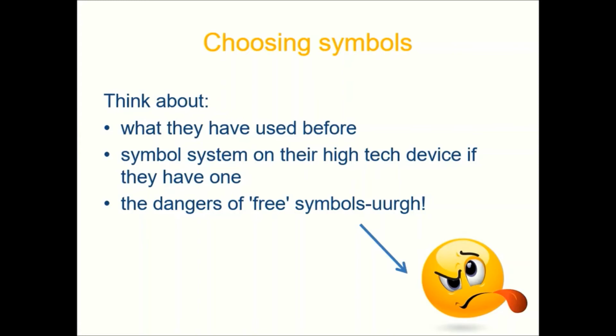So this one, for example, we've given as an example. What does that mean? That could mean a range of things. It could mean frustrated or annoyed or disgusted. So we do recommend investing in symbol software if you can.